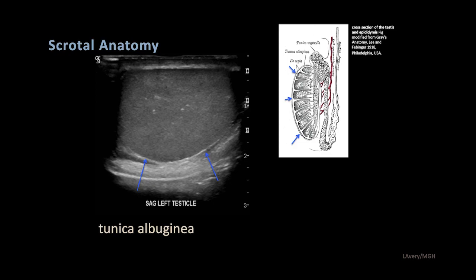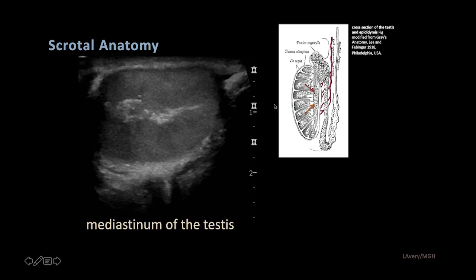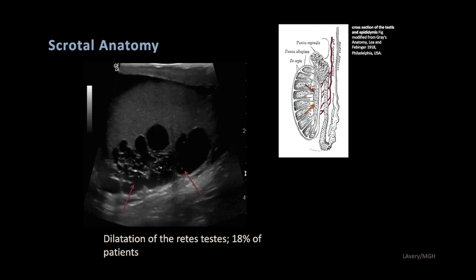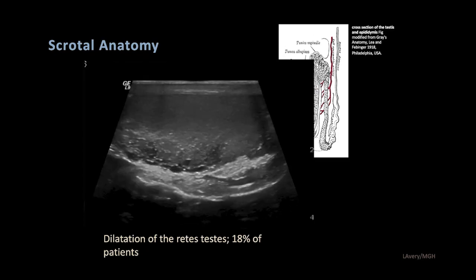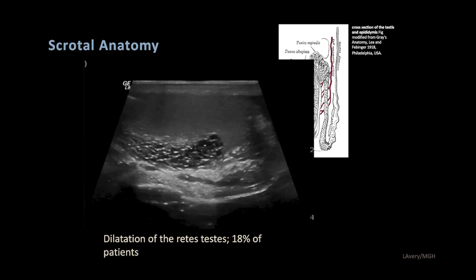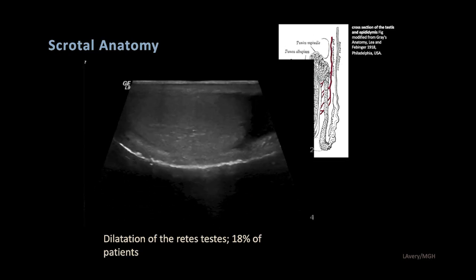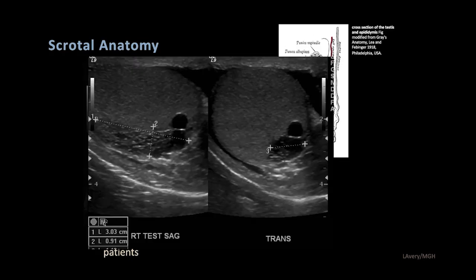Here we have the normal sagittal image of the testicle, very homogeneous in echo texture, surrounded by a very echogenic band of fibrous tissue known as the tunica albuginia. This tunica albuginia extends into the testicle and can be seen as this echogenic band in the mediastinum. At times within the mediastinum of the testis, there will be dilatation of the rete testis — anechoic dilated tubules, as seen here. This is present in up to 18% to 20% of patients and increases with age. It's a normal variant.